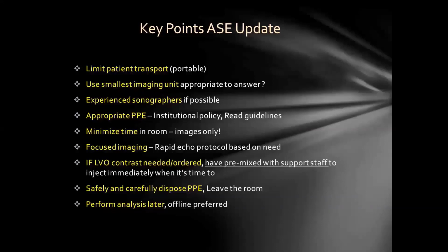You only want to take the images and not do a lot of analysis. So you want a focused imaging protocol. You want a rapid acquire echo protocol that's probably already developed by your hospital or institution, and it's based strictly on the need at the bedside at that time.